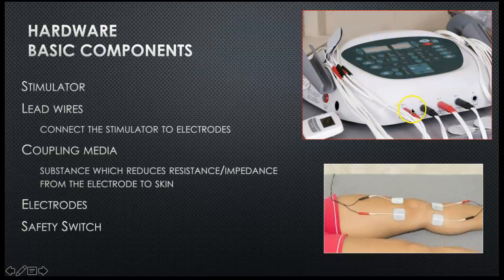The lead wires, each one of these is a channel or a lead. And actually, that's a channel. You see that, and they all have two leads. So each one of these is a lead. That's where you connect the electrodes to the lead wire right there.